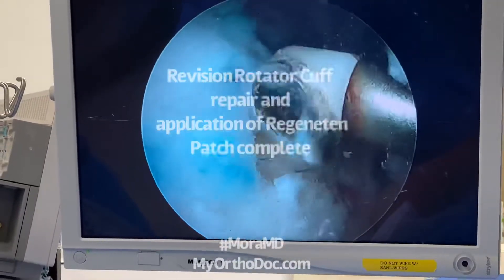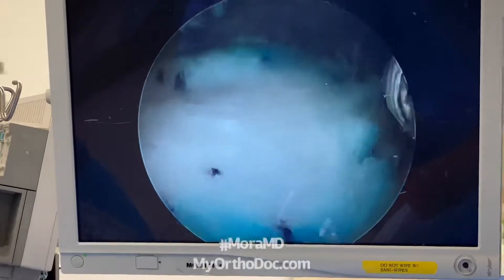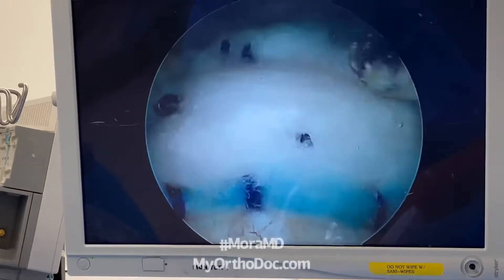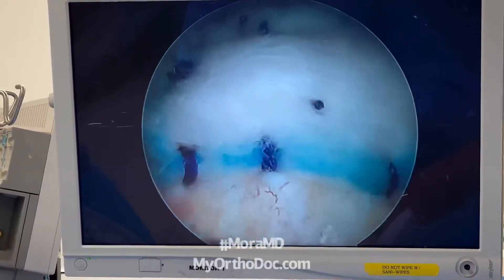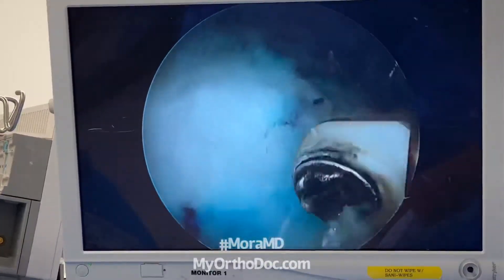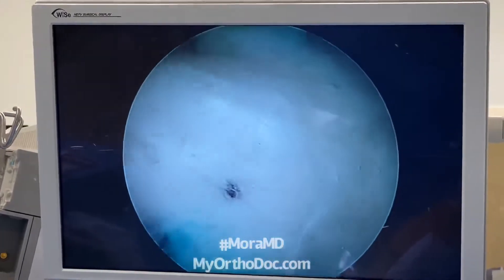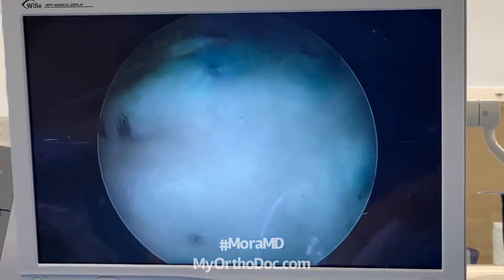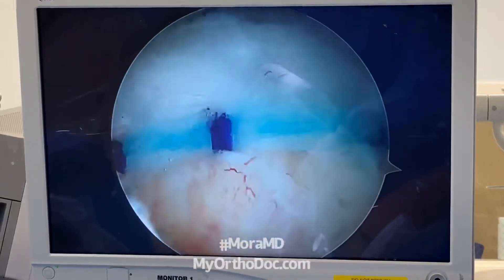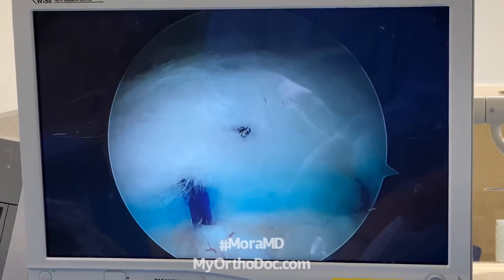I'll show you the Regeneten graft — I just finished doing it. I'm just smoothing out or feathering the edges. Like I said, this is like a patch on your Levi's or your jeans. You can see the blue edge. I'm going to secure the edges a little bit better. This was a revision rotator cuff repair — I attached this collagen graft to thicken up the damaged tendon.